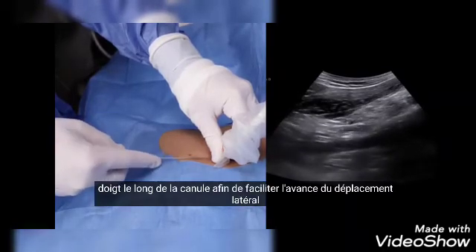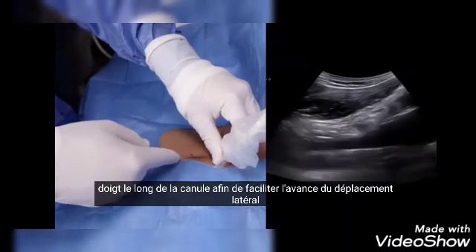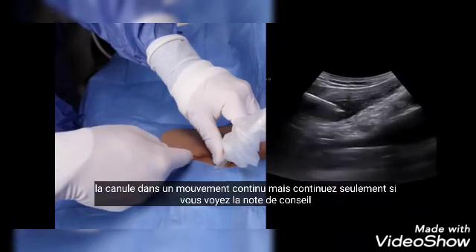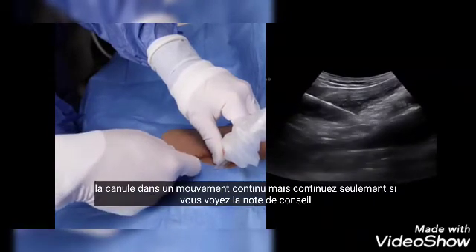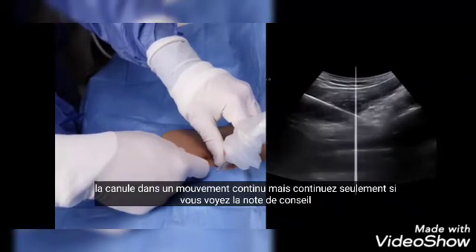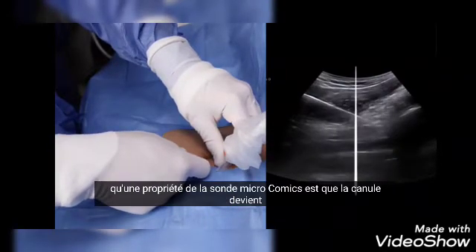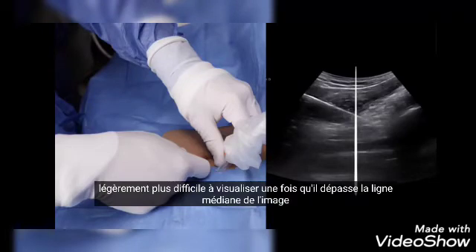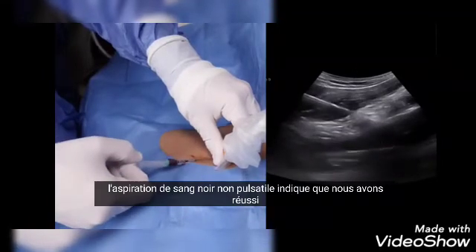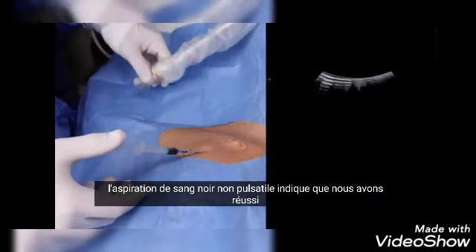Use the empty 2cc syringe as an improvised handle and place the index finger along the cannula in order to facilitate lateral displacement. Advance the cannula in a continuous motion but proceed only if you see the tip. Note that a property of the micro convex probe is that the cannula becomes slightly harder to visualize once it passes beyond the midline of the picture.